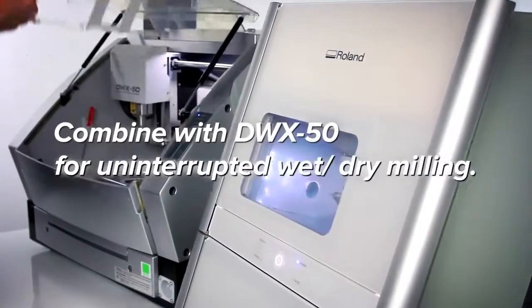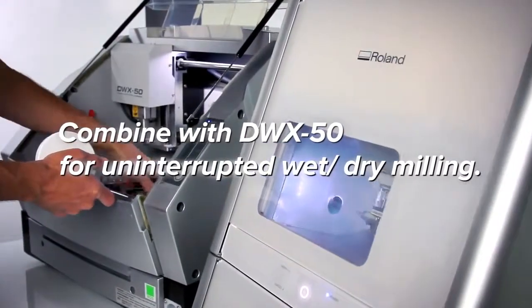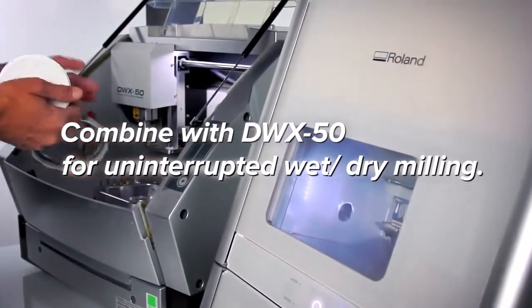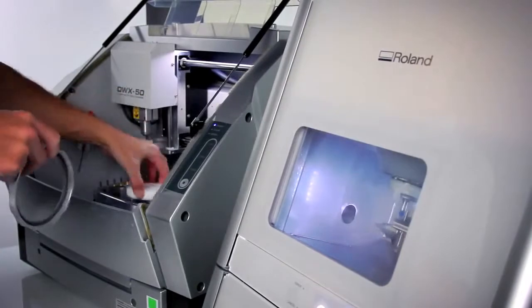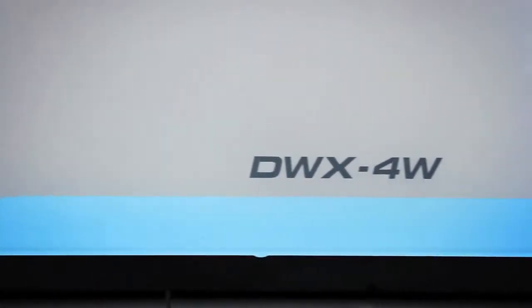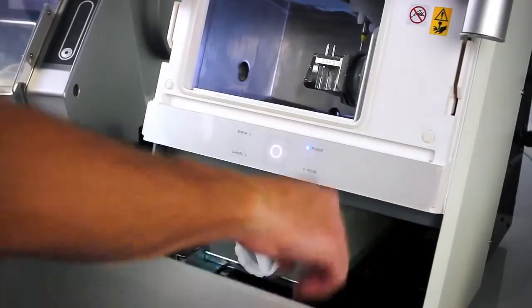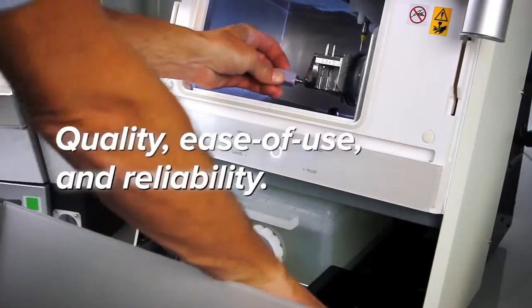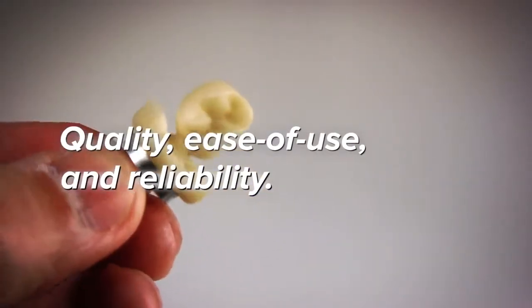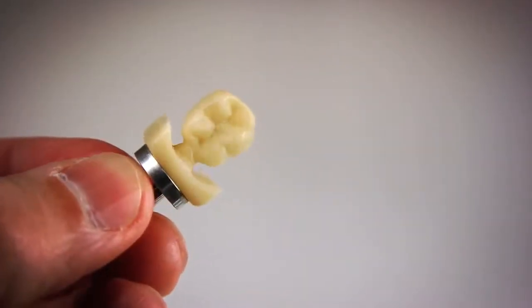Combine the DWX-4W with a DWX-50 for uninterrupted wet and dry milling that increases the flexibility and productivity of your business, all with the cost, quality, ease of use and reliability the DWX series is known for.